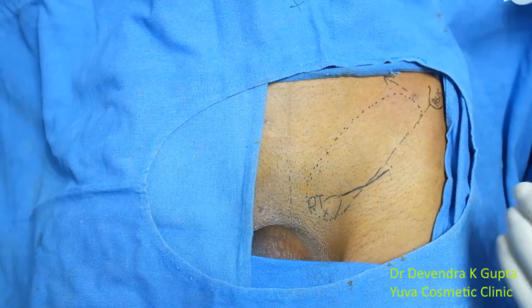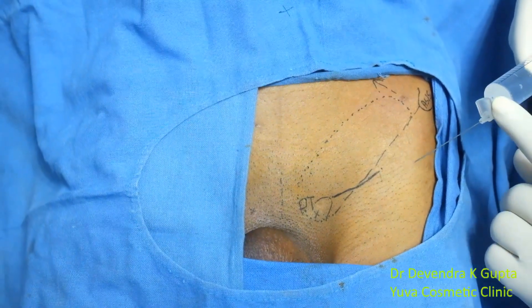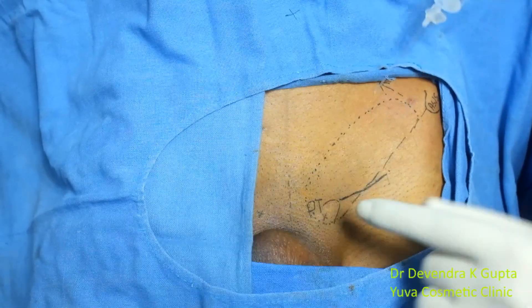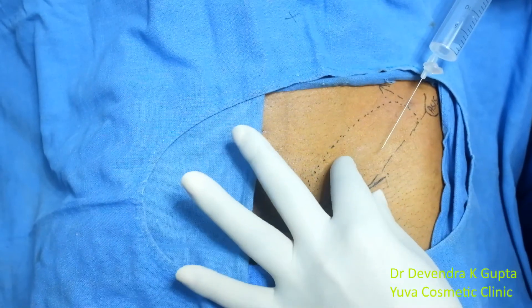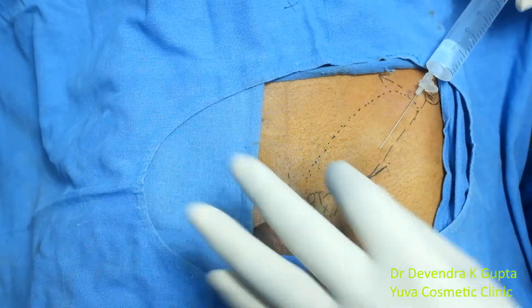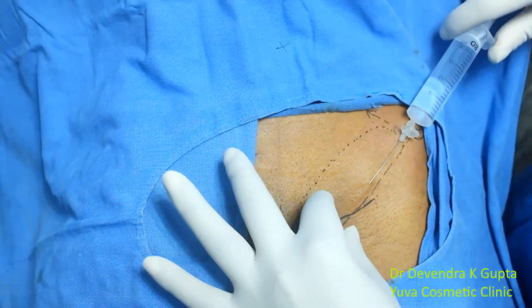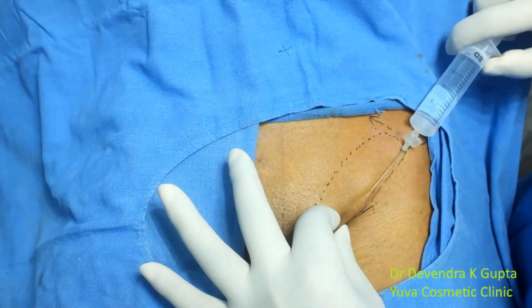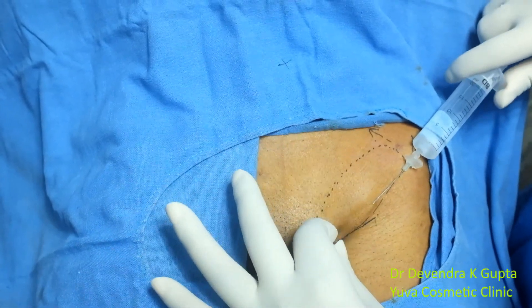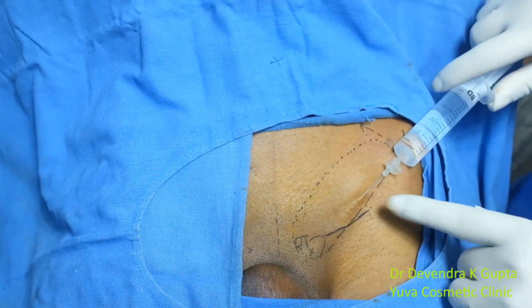I have marked the incision line with a solid black line and will infiltrate the skin to minimize bleeding and keep the field clean. I have taken a 22-gauge needle from a 20-gauge intracat. I insert the needle from the already anesthetized area, pinch the skin, and puncture from the anesthetized area so the patient does not feel pain. Aspirate, then infiltrate — this is the tumescent solution.